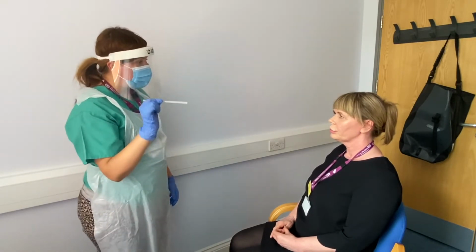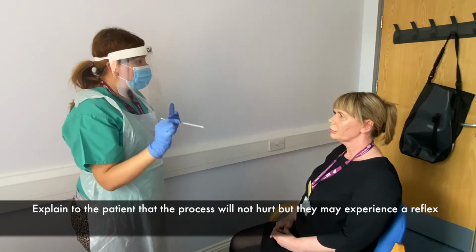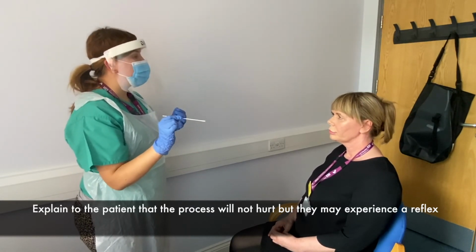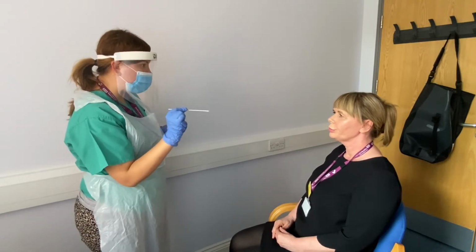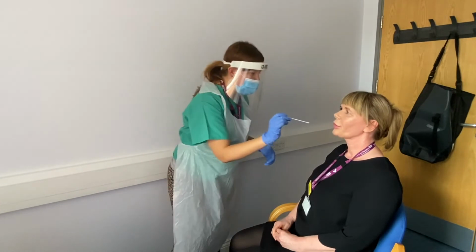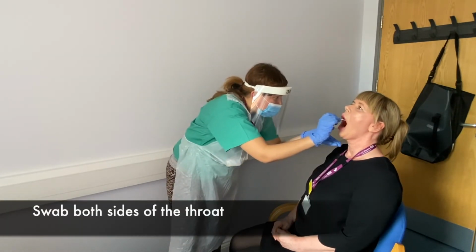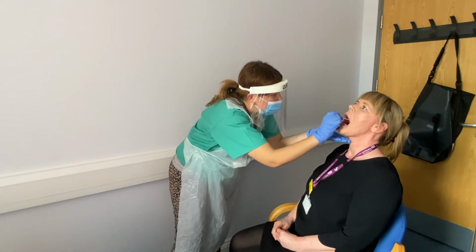Okay, and I'm going to swab the back of the throat. You might feel a reflex that might want to make you gag. It doesn't hurt, and you might feel like you want to cough. Okay, but it won't take very long. Are you ready? Yes. Okay, if you open your mouth wide, and we do one side, and then we do the other side.